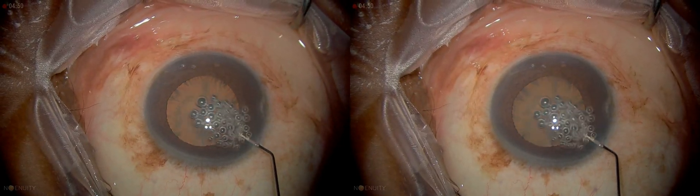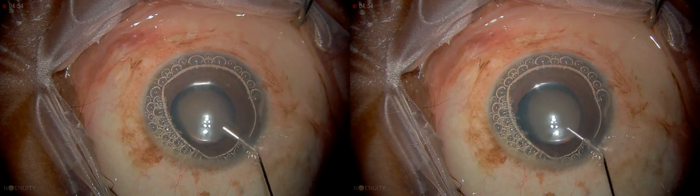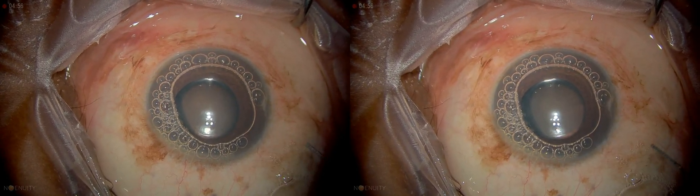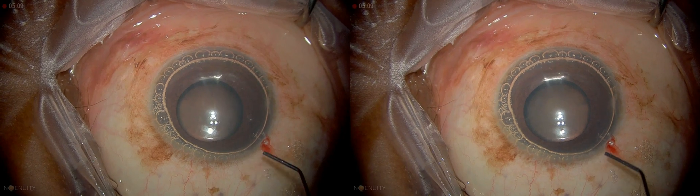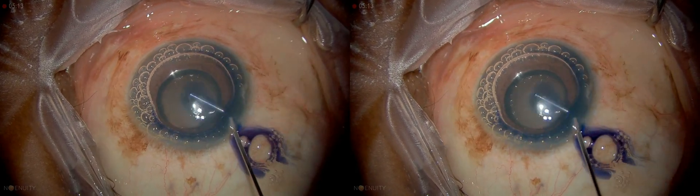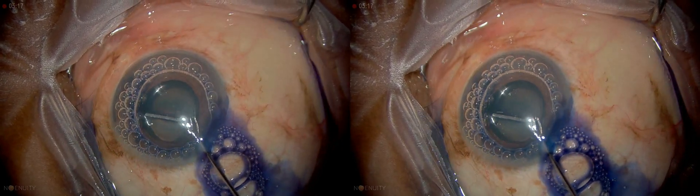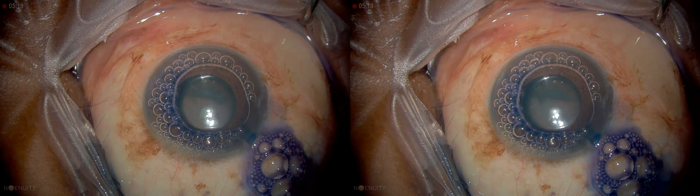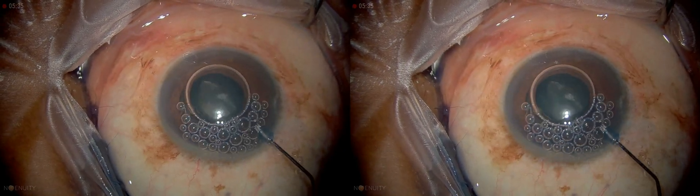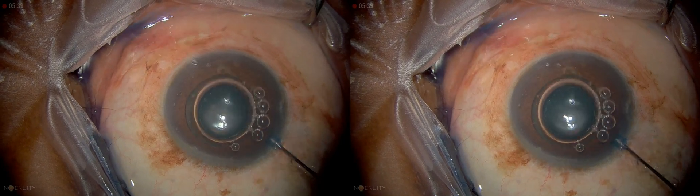We're going to put in some air here. That's always a little troubling, having those small bubbles. I like to make sure I have enough air. The issue with TriPan is people put too much in, so I just put a few drops in the center, if possible, and I actually paint it on the surface — just wipe it across the surface. It doesn't need to be there very long. Just irrigate until the blue is gone.